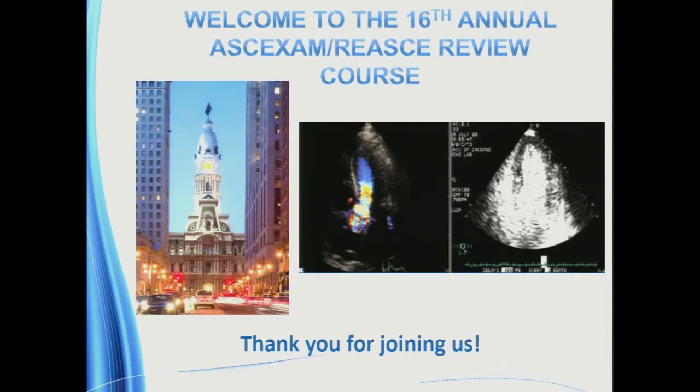So they're really not talking about post-systolic shortening in this. Although intellectually very valuable and perhaps clinically useful, I'd be very surprised if those types of questions came up in the exams. But yes, you can see post-systolic shortening in normal individuals.